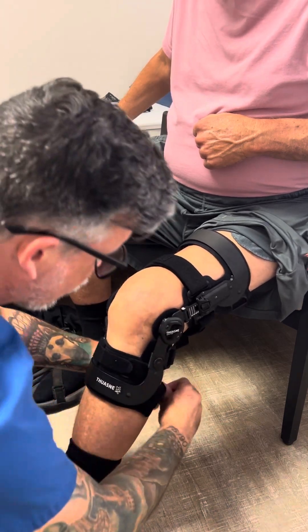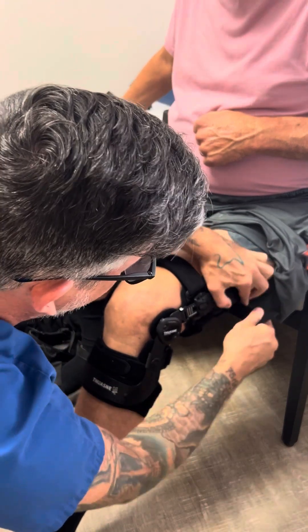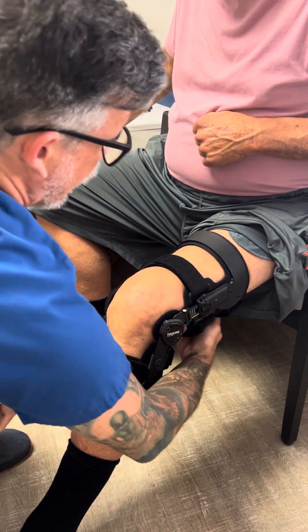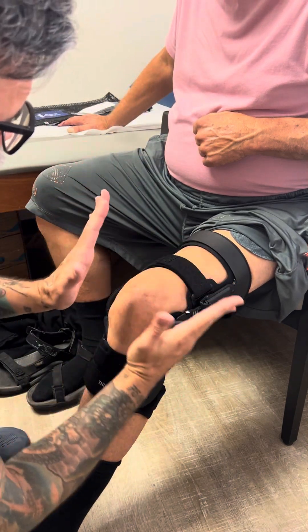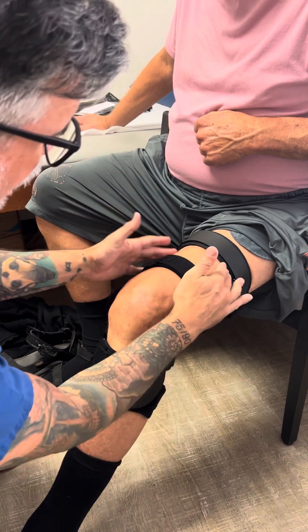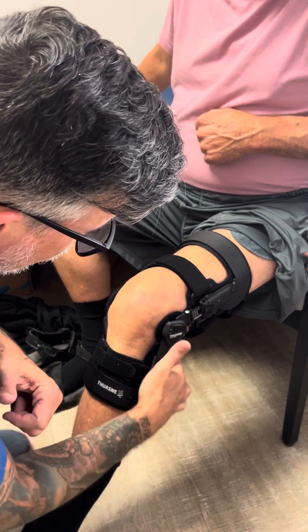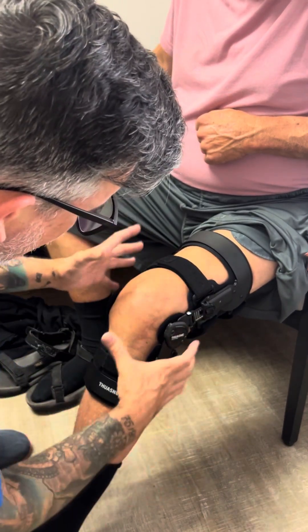Give a good snug fit. The most important strap is that first one right above the calf because it really grabs onto the ball of the calf. A lot of brace companies will tell you not to over-tighten the top thigh strap — not only because patients sometimes complain, but more importantly because the thigh is shaped like an upside-down triangle. If you tighten the top one too much, soft tissue can actually squeeze the brace off the leg a little bit. The strap that really works the most is the one right above the knee, and then the one that grabs the thigh just above the knee to hold it up.